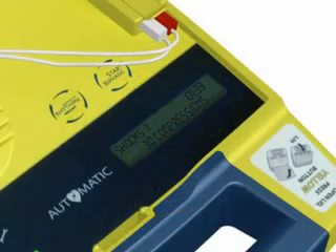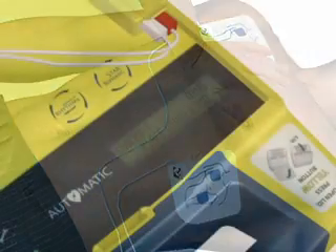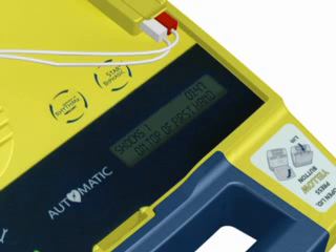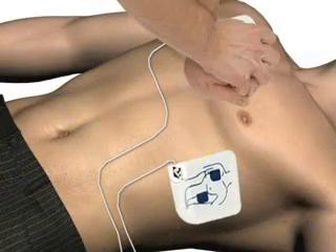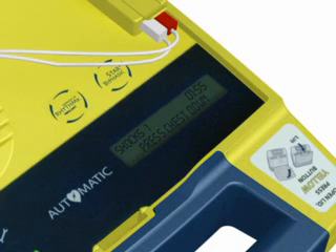When instructed, give the patient 30 rapid compressions, then give 2 breaths. Place the heel of one hand on the center of the chest between the nipples. Place the heel of the other hand directly on top of the first hand. Lean over the patient with elbows straight. Press the patient's chest down rapidly, one-third depth of chest, then release.